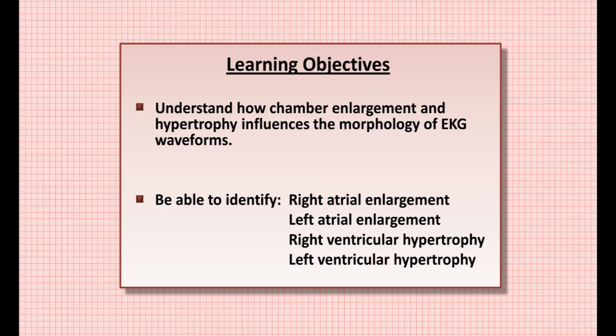Before I begin, I want to point out that the biggest source of frustration medical trainees face with diagnosing these conditions on EKG is memorizing long lists of individual criteria. While I will be reviewing many of these criteria, it's important to realize that there is great variability between providers as to which specific criteria are used in practice, and none of the criteria are particularly sensitive and specific. In general, understanding the pathophysiology of the changes of chamber enlargement will allow you to predict indicative EKG features, which will partially alleviate the need for memorization.